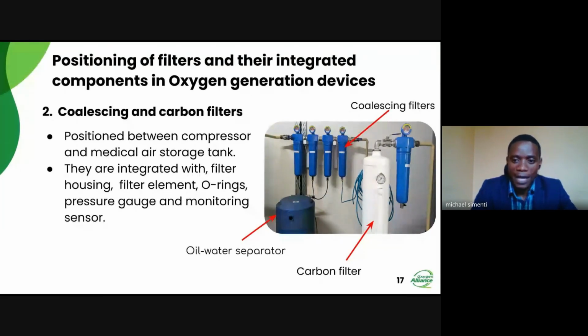And apart from that, inside the filters, what you see outside as bluish in color is just a casing. The filtering element is inside. So there are those filter elements. There are also some O-rings which create a tight seal so that there shouldn't be any leakage as these filters perform their functions. Right, so there are also some other scenarios whereby these filters are incorporated with monitoring sensors.